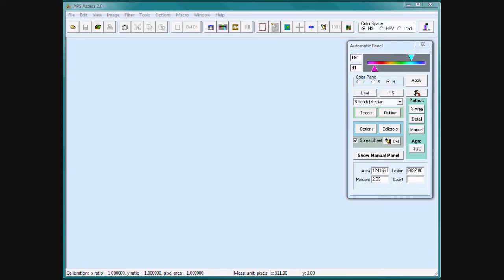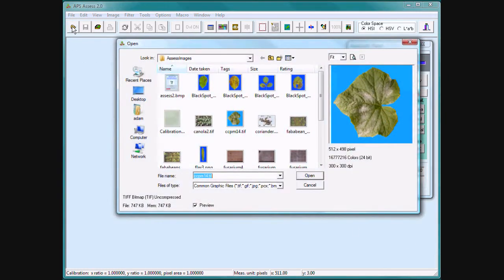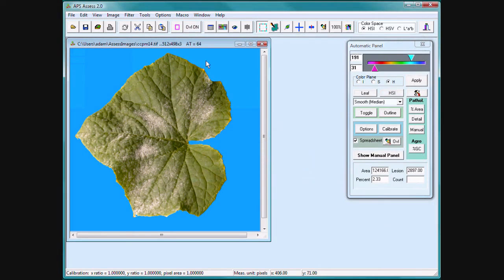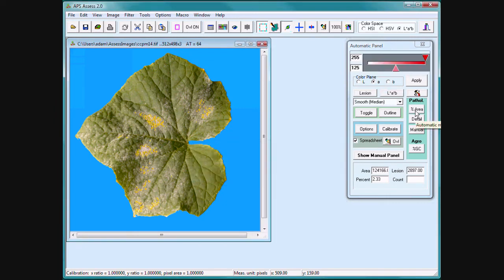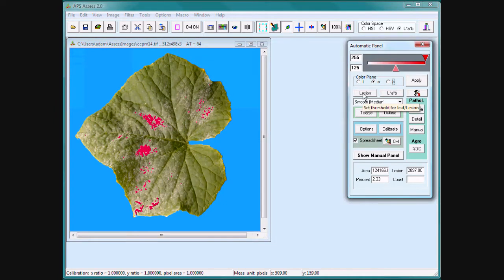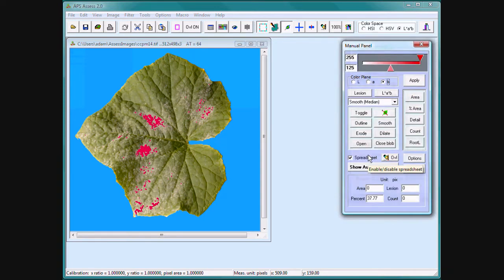If the disease you wish to quantify does not lend itself to automatic processing, as in this example of powdery mildew, you can always revert to the manual panel. Click on Show Manual Panel.